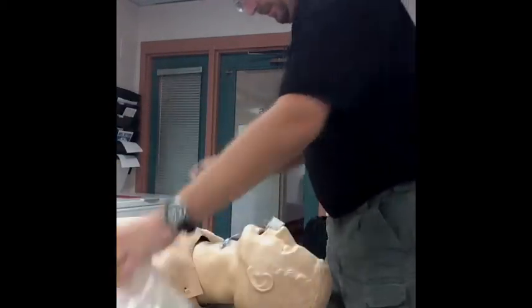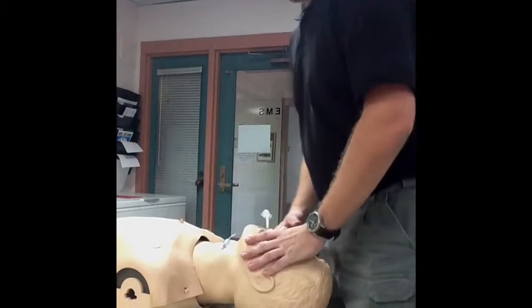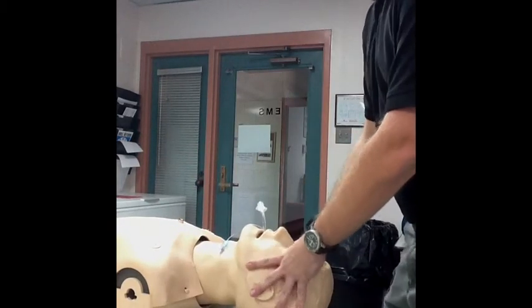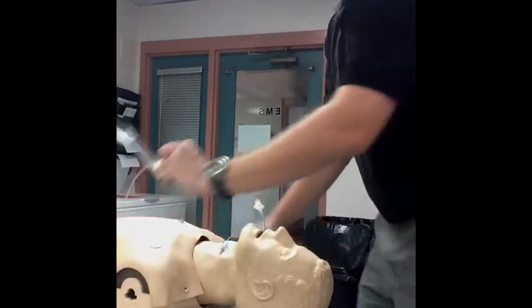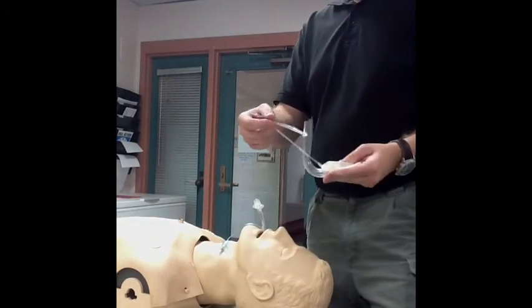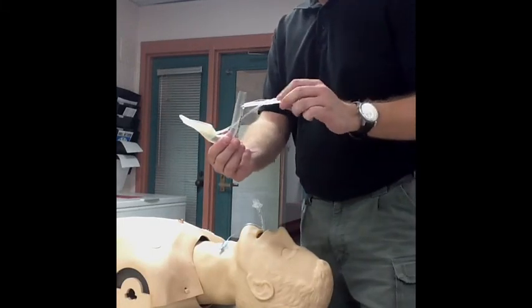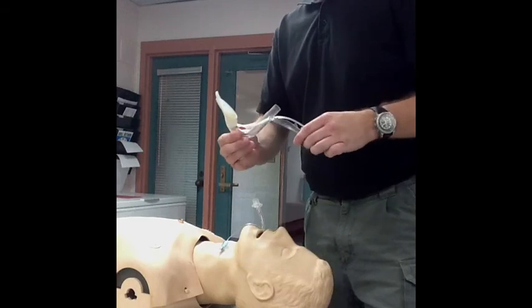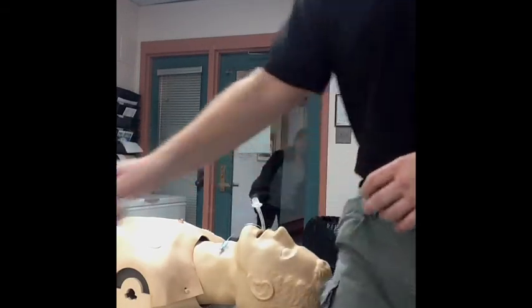Go ahead and properly secure the tube. I wouldn't necessarily recommend the LMA removal step out in the field, but it is something you may see. Hopefully this has been a brief and enlightening introduction to the Intubating LMA, or the LMA Fast Track — the disposable device you may encounter in the pre-hospital environment. As always, thanks for hanging in there.